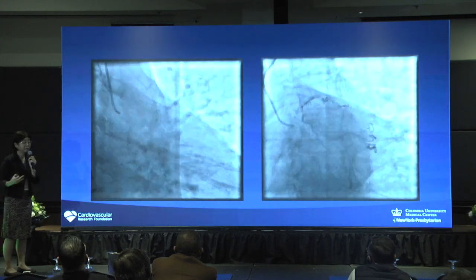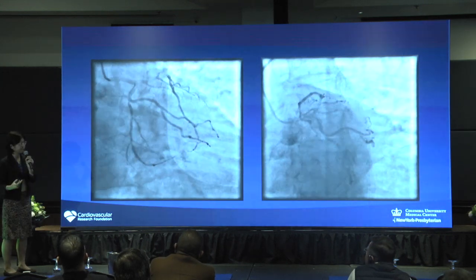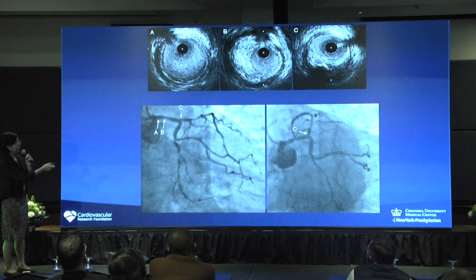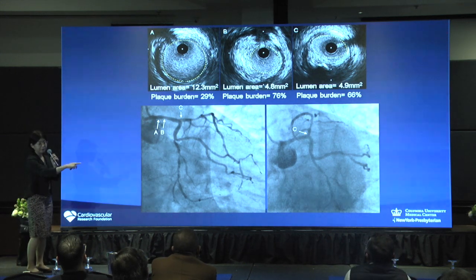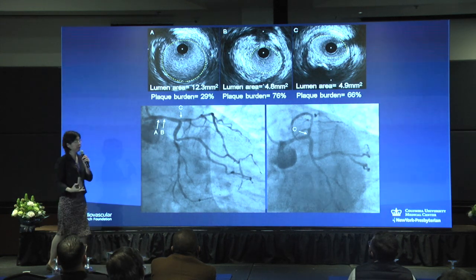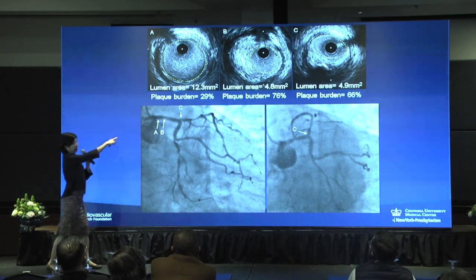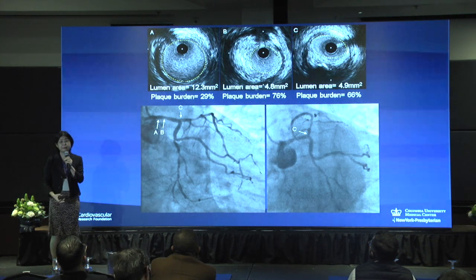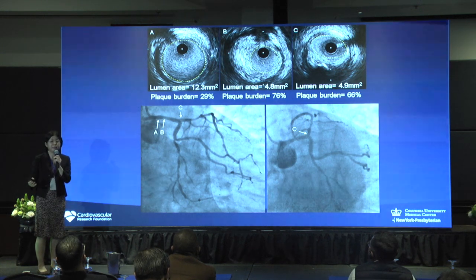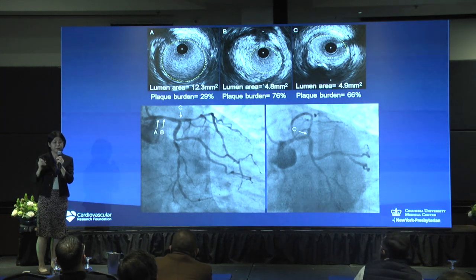We are not very clear, because if we say diameter stenosis, I think this is almost like 20-30%. Doesn't look bad, right? This is IVUS, and I'm surprised. Actually, mid left main was quite significant. You see the mid segment corresponding MLA is 4.8, which is very significant and very diffuse disease. And LAD ostium is also 4.9. So that's changing the whole strategy. Or if you don't do the IVUS, you may say this left main is okay. That's a big mistake. So I think number one importance of the left main is correct diagnosis.